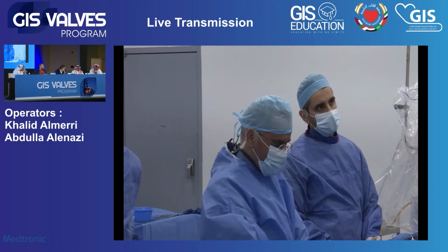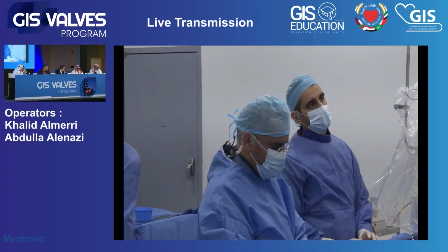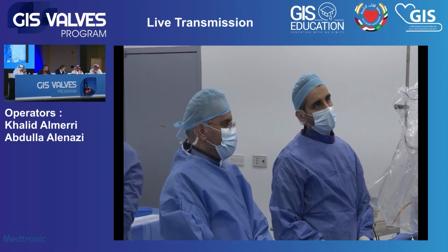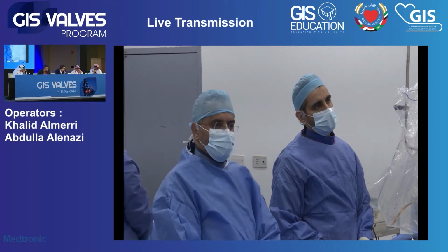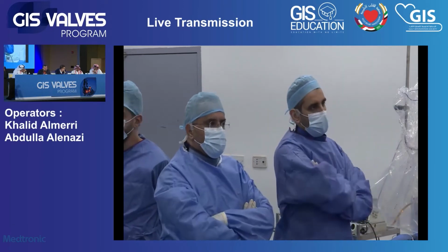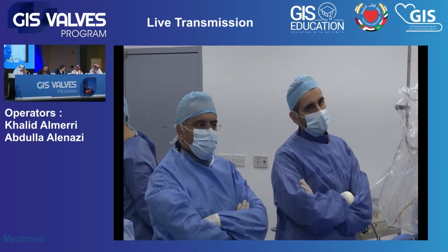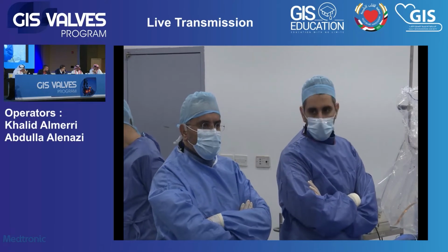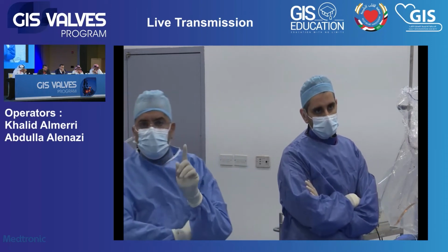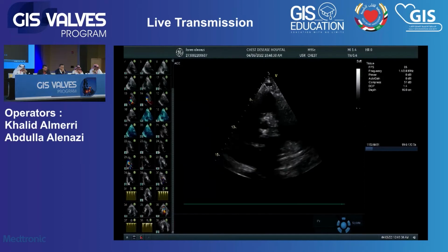It's well known that the pathology of bicuspid valve is different than the normal aortic valve stenosis. So you would expect that the true annulus will be higher because you are taking the orifice of the bicuspid aortic valve as your annulus instead of the usual way of doing it. So usually it's higher, and the size is probably smaller. That's why we need to do pre-dilatation with the balloon that will seal completely the valve when you are preparing the lesion before putting the valve.